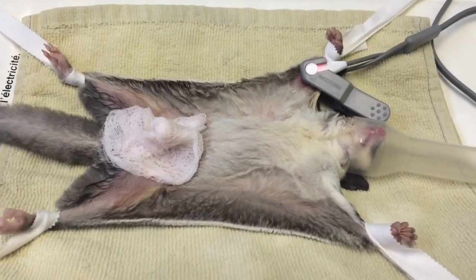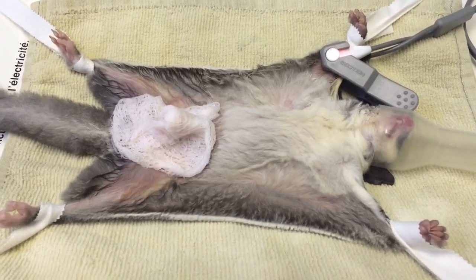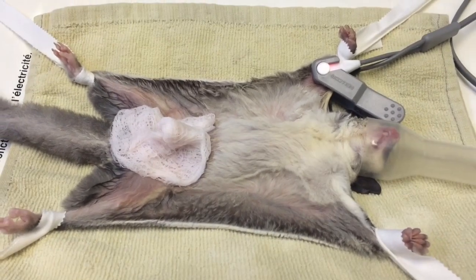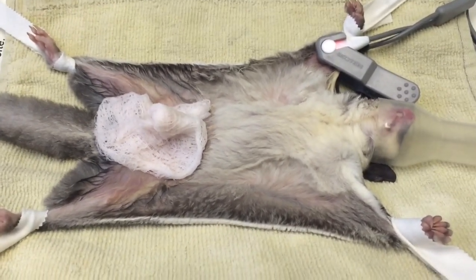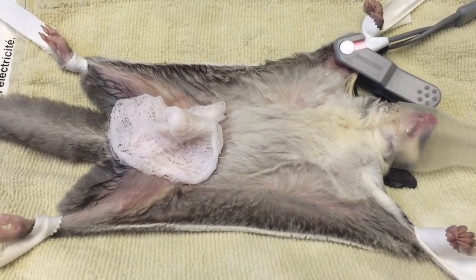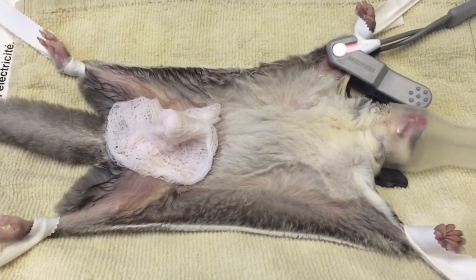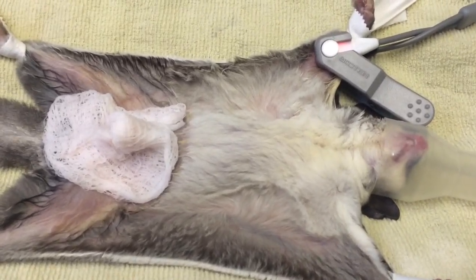All right, here we are — castration post-op experiment 3529. There again is our testicle being soaked in some chlorhexidine solution to make sure that it's clean and sterile. The area has been clipped and prepped. I just like to let it soak for a few minutes to make sure.